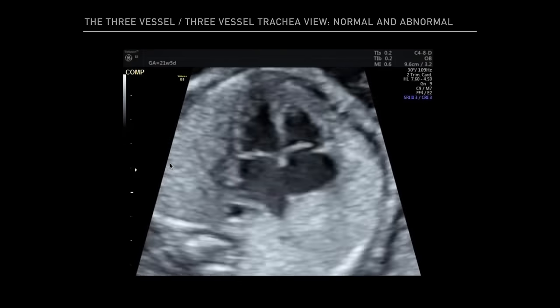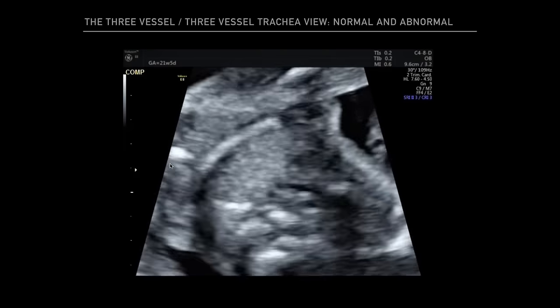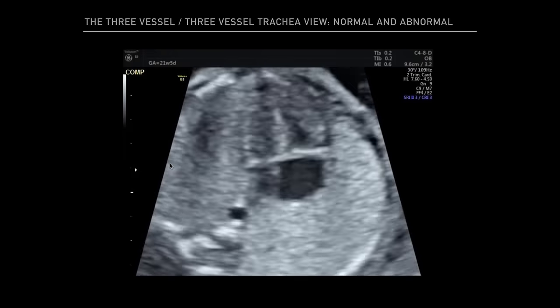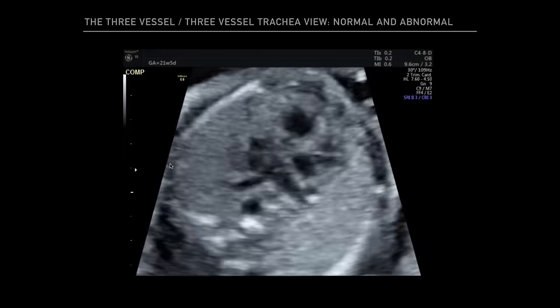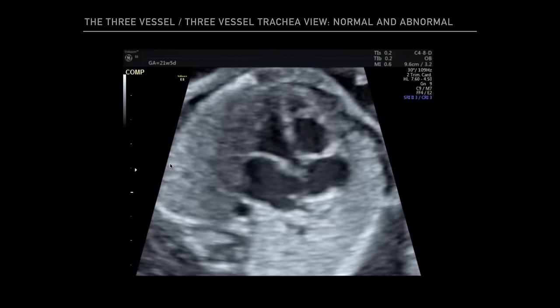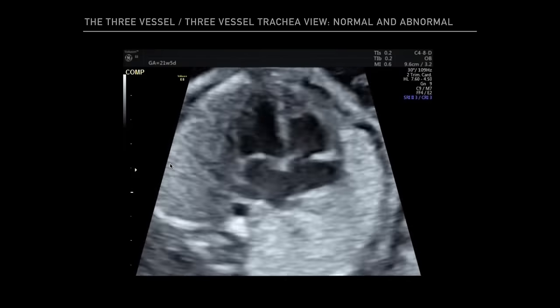And with a very simple sweep starting from the four chamber and angling up towards the head, this very small 3 second sweep, we're able to rule out major congenital heart disease, even more so if you were to apply color Doppler in interrogating these areas.